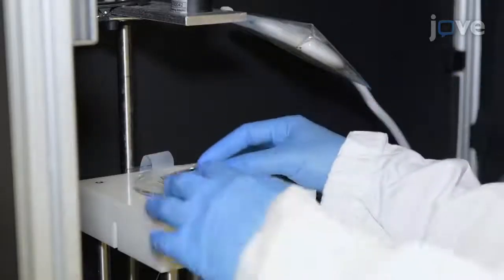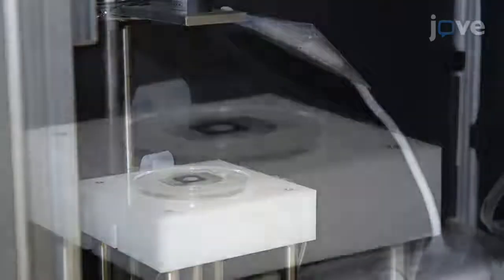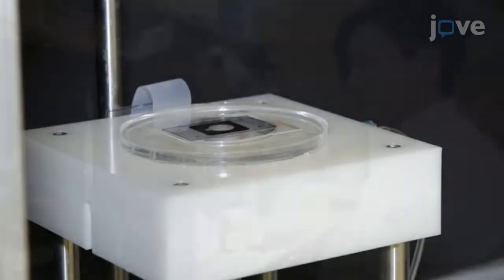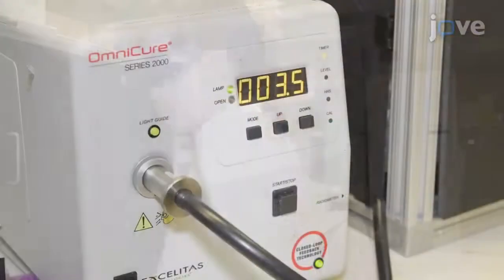Next, place a photomask with the desired design on top of the top substrate. Ensure that the mask is in full contact with the top substrate and aligned to the substrate's bottom. Place on protective UV goggles. Then expose the hydrogel prepolymer to UV light through the photomask.